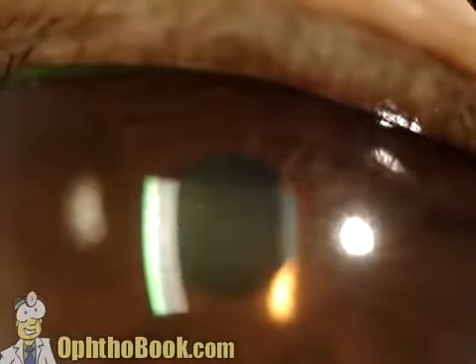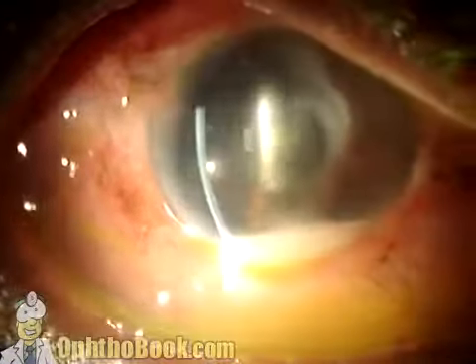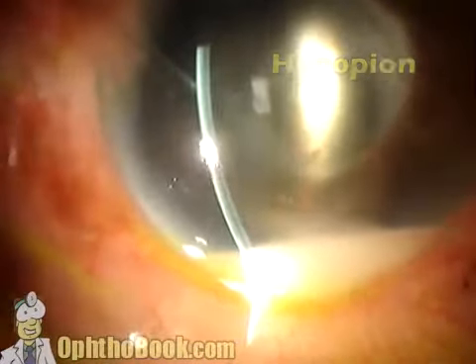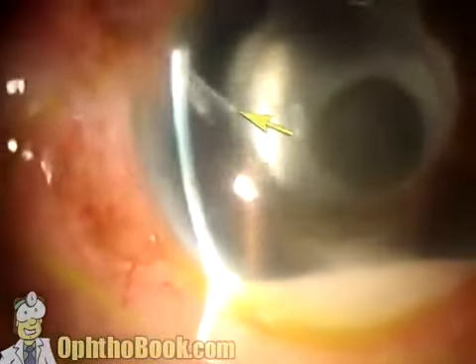The brighter the light, the easier it's going to be seen. And if you use the pupil as a background, it makes it a lot easier. This is more flare, less cell, but you get the idea. You get enough inflammatory cells, they'll settle to the bottom, form that hypopyon we looked at before. They can be sterile or infectious. This is probably from an infection from this tube shunt that went bad.